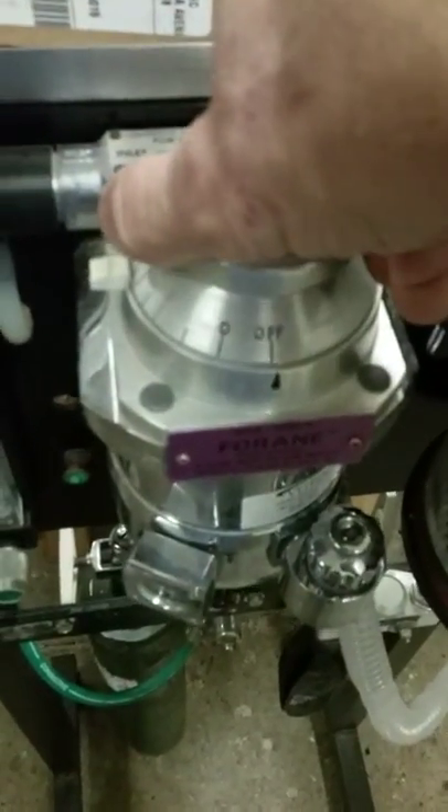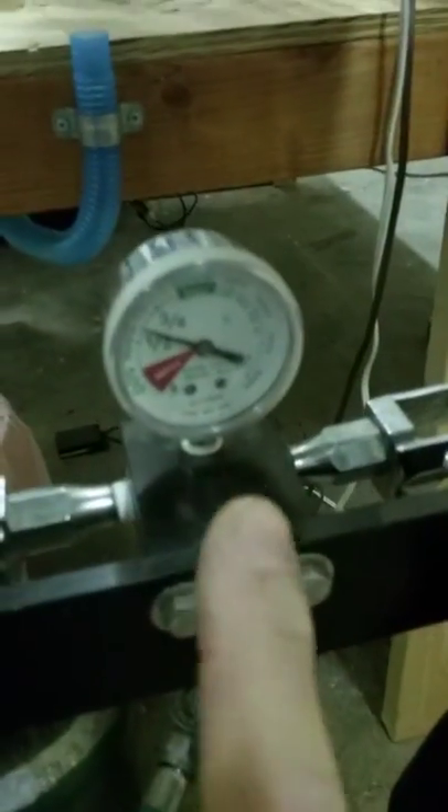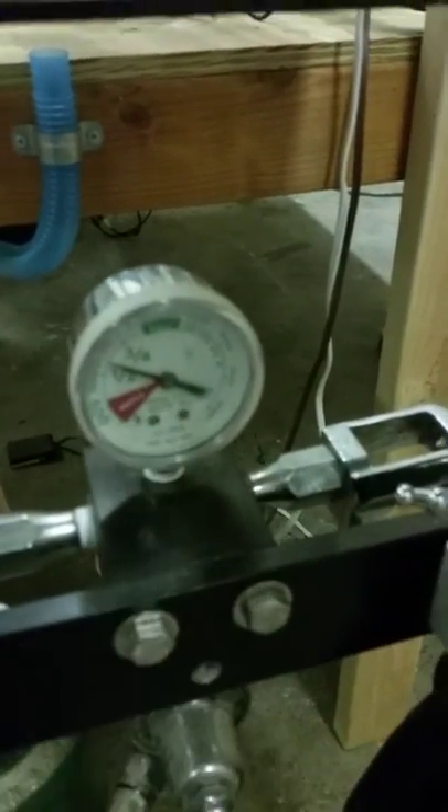Turning it off is just the reverse: shut off the vaporizer by turning it to zero, then quickly turn off the adjustable flow regulator — the flow meter — and then finally tighten up the tube at the top of the oxygen tank.